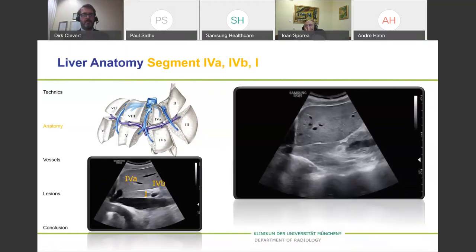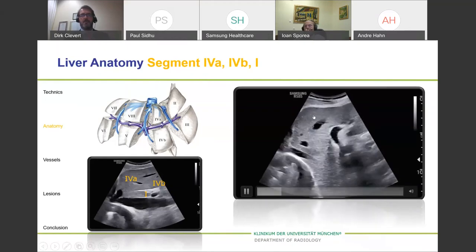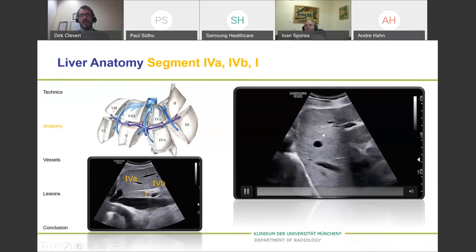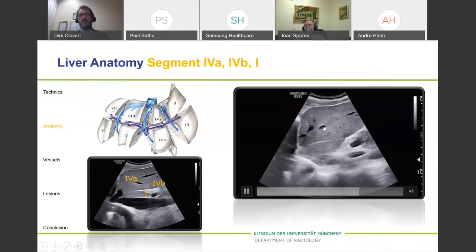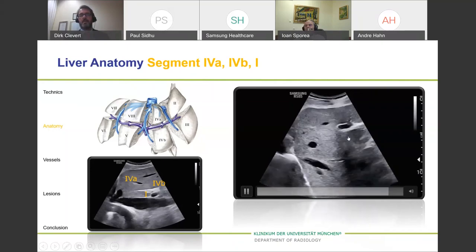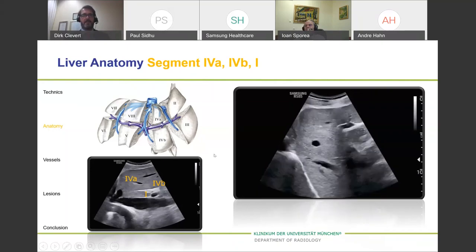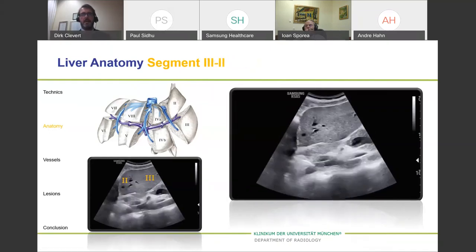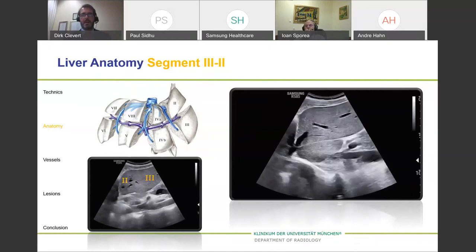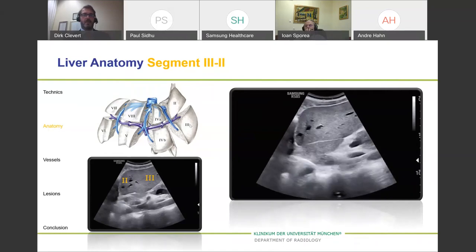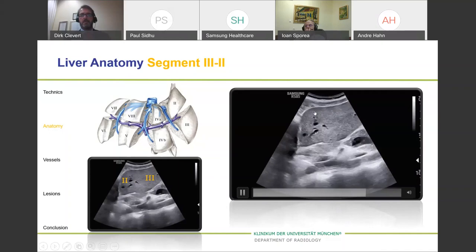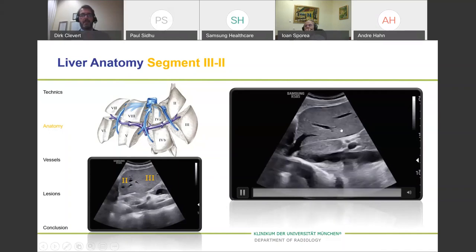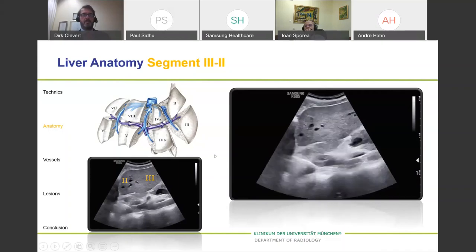Going further, we see the IVC and the very small segment one. On top is segment four A, where you can see the liver vein and part of the portal branch. In this area we have segment four B. Finally, going to the lateral part of the left liver lobe, you see segments two and three, as also shown in the Couinaud animation.